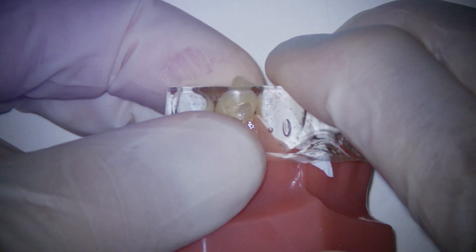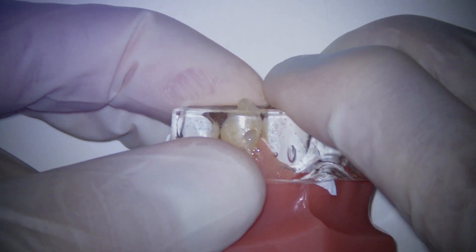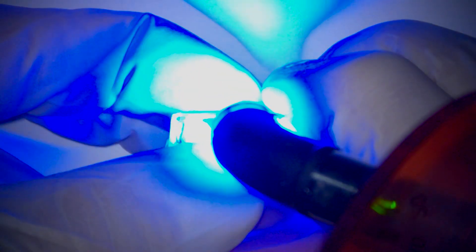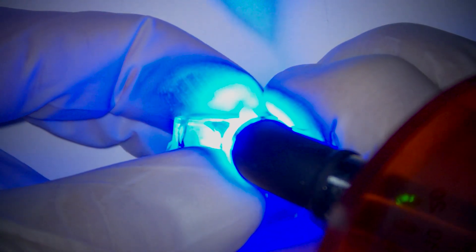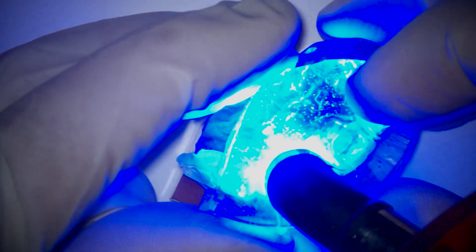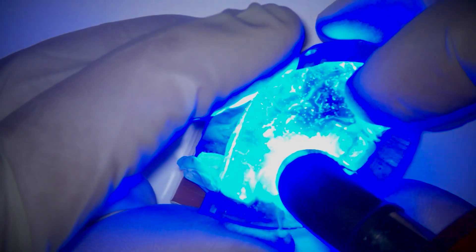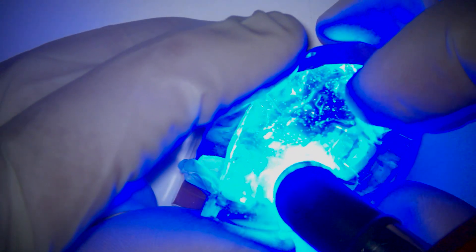I am going to apply pressure on the buccal and lingual, again to make sure it is well adapted. Now we are going to have your assistant cure. We are going to cure this for a full 20 seconds from the facial, and then we are going to cure it for a full 20 seconds from the incisal and the lingual.